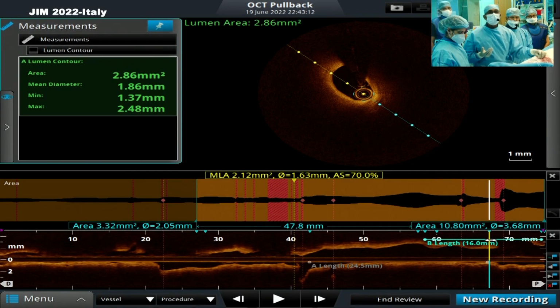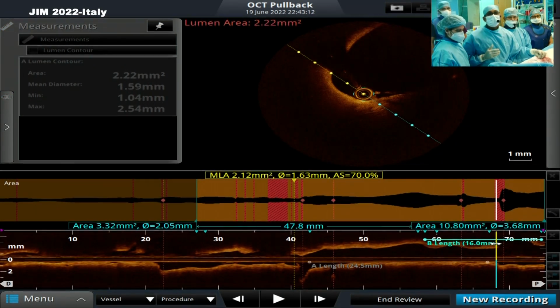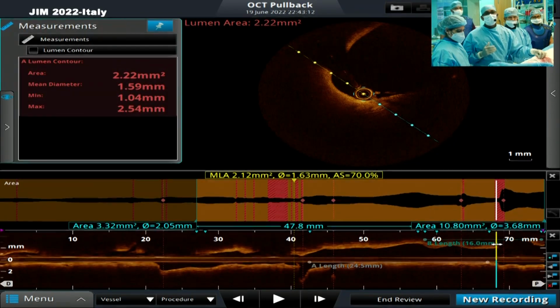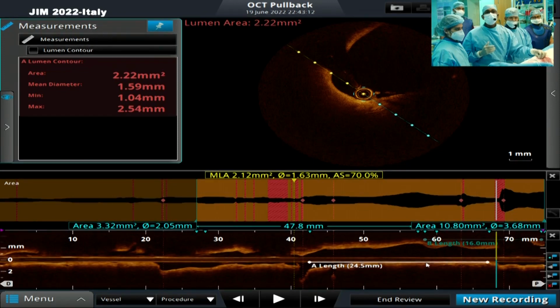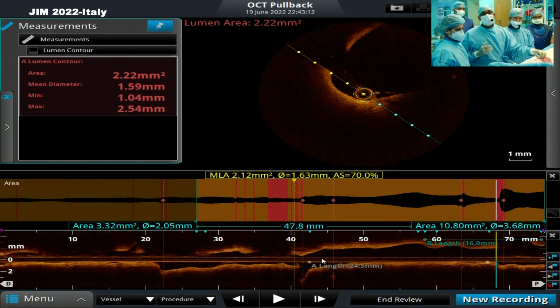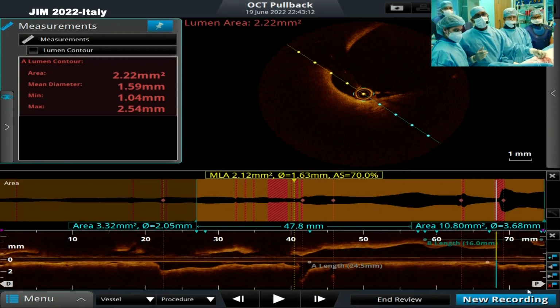Would you really want to position it right at the ostium of the LAD? It's from 70, quite frankly, until like 40. So it's about 30, around 24. So a 38 stent might be able to cover the whole thing and spare the left main.